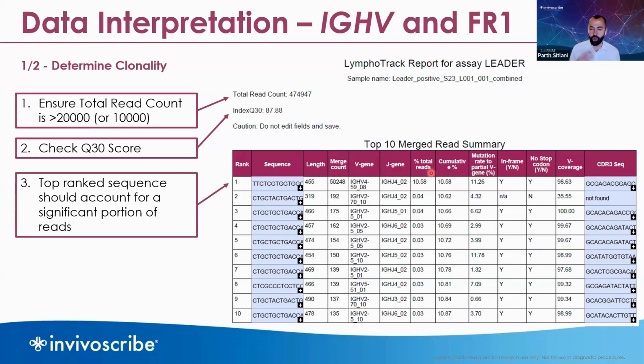Because these assays are RUO, we don't have clinical interpretation guidelines listed here in this presentation. However, I'll share some publications with you that show how that interpretation is done at different institutions.